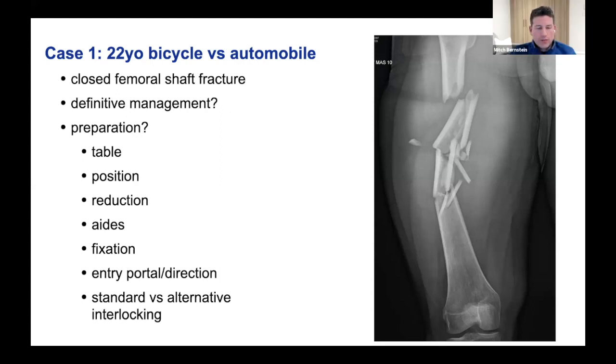A reduction would be important for me. I mean, the positioning for me really doesn't change. It's always supine. I always do a piriformis entry, just because the proximal segment, I'll be able to sort of negate that from the alignment as it's collinear with the canal. So that would be for me, reduction.